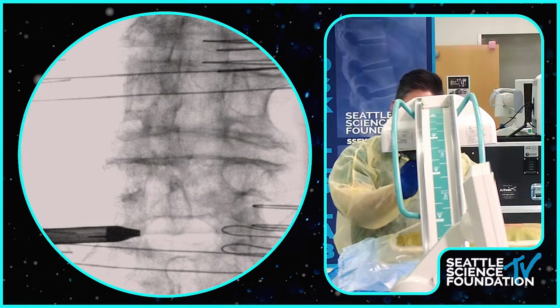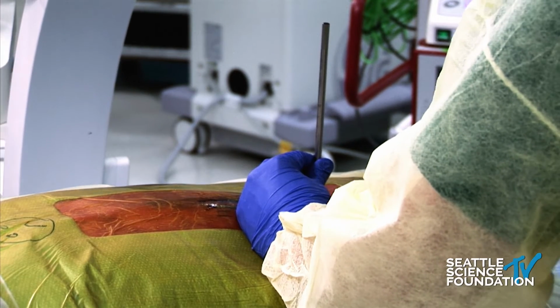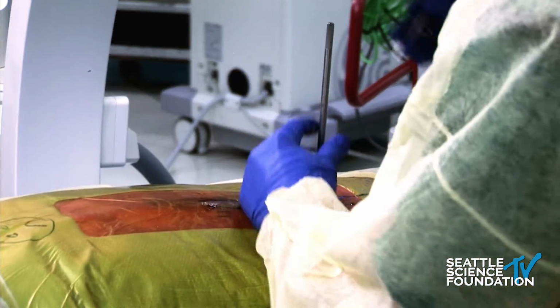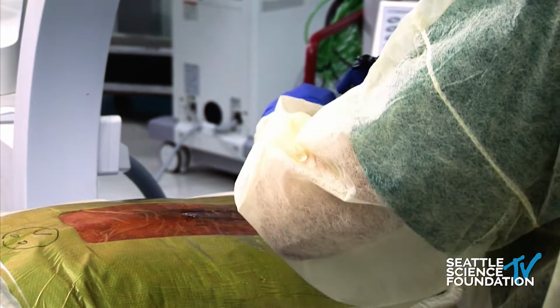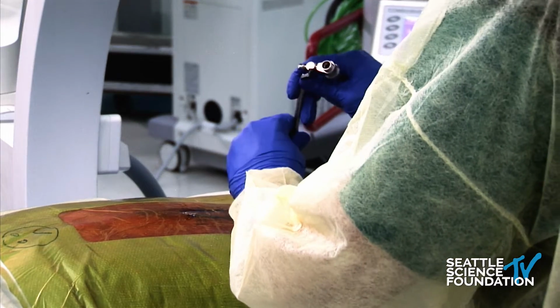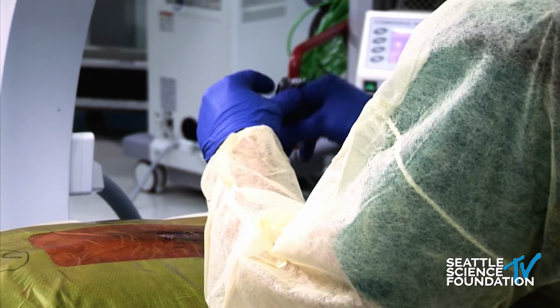And so usually it takes... You can come up a little bit. Usually it takes a couple of shots to localize this on the AP. And I make an incision, and I put the dilator. So with the dilator, I can feel the sacrum, and this is the L5 lamina. In the middle, soft stuff. This is the yellow ligament, and then I dock my tube there.